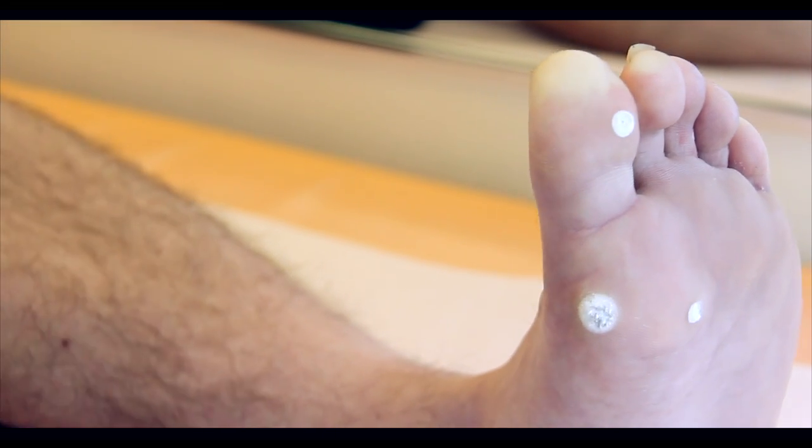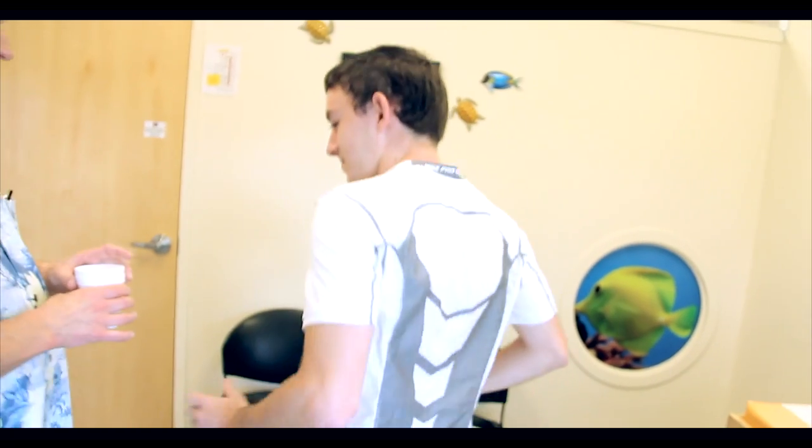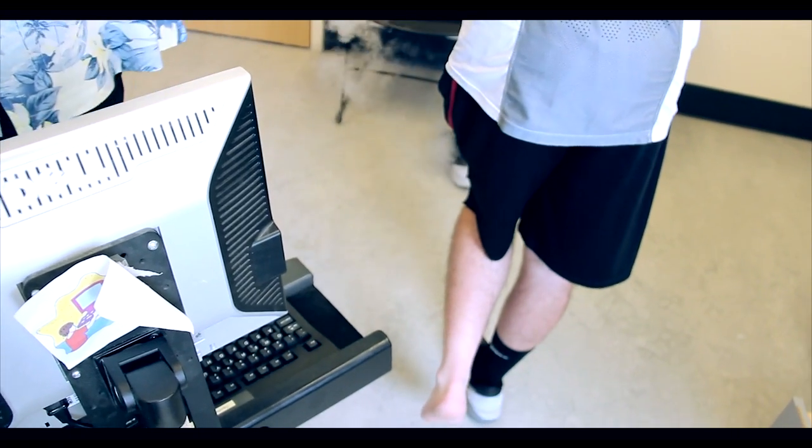Done. All right. You did good, man. This stuff's tough. You do get one reward for allowing me to torture you — you get to dump that on the floor, but don't dump it on your shoe. Well, there you have it, folks. Another amazing wart and another amazing patient who let me torture him pretty bad and did it with character and courage.